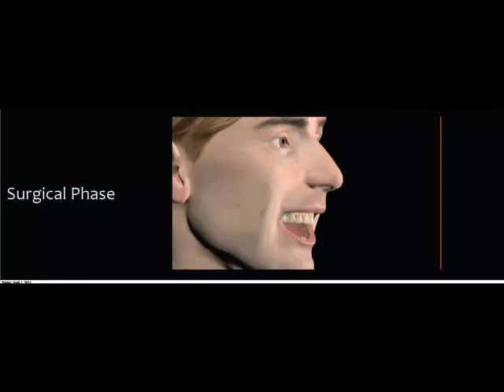Now with the surgery, the most important step is atraumatic removal of the teeth and preservation of the soft tissue and the hard tissue. We seat a surgical template in the patient's mouth. We place our surgical putty index, and now we're going to stabilize that surgical guide using our horizontal anchor pins. Once the guide is stabilized, we're going to remove that index, and we're going to start preparing our osteotomies.